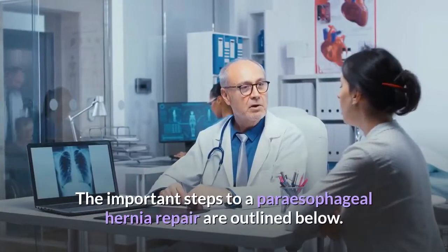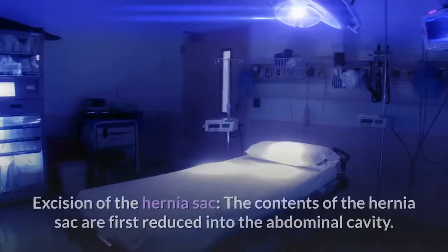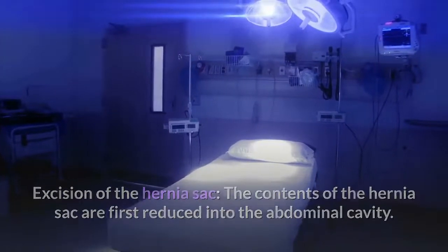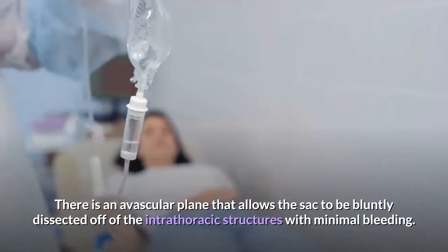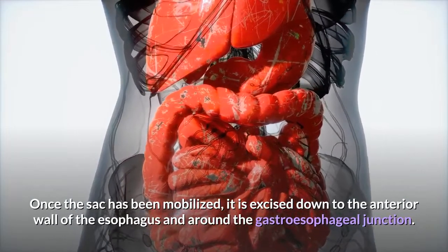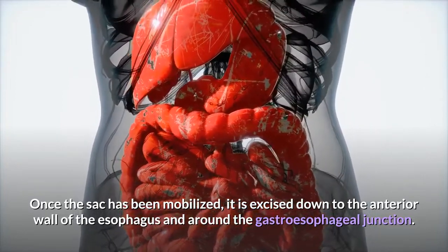The important steps to a paraesophageal hernia repair are outlined below. Excision of the hernia sac. The contents of the hernia sac are first reduced into the abdominal cavity. There is an avascular plane that allows the sac to be bluntly dissected off of the intrathoracic structures with minimal bleeding. Once the sac has been mobilized, it is excised down to the anterior wall of the esophagus and around the gastroesophageal junction.